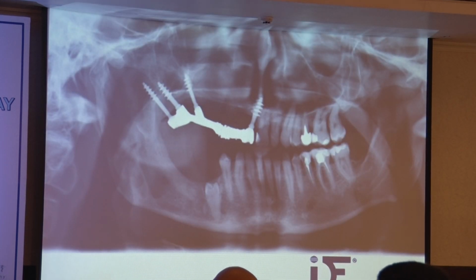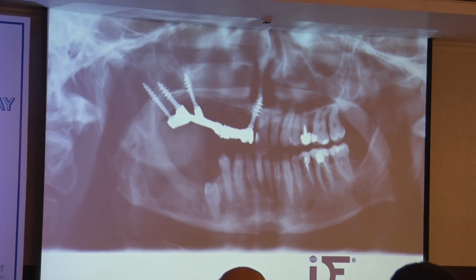This is a segment which we did in a case where the maxilla was almost completely missing. 2 tuberal pterygoid implants, one 20 millimeter BCS implant in the stump of the zygomatic bone, and anteriorly the central was extracted in order to make a space for one implant. I don't recommend to connect those distal 3 implants to teeth on the front. I think this will not work, so I rather took the central out, and the lower jaw has to be also equipped. So this is an example.